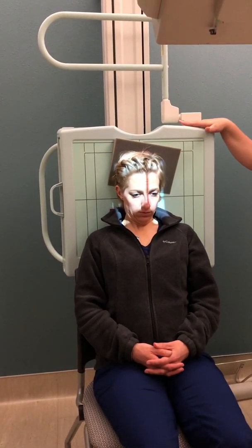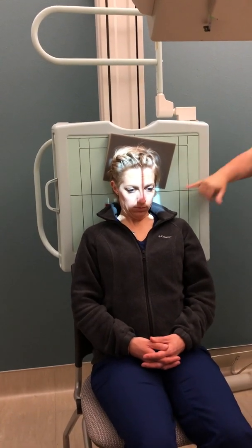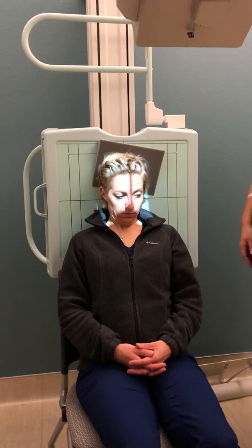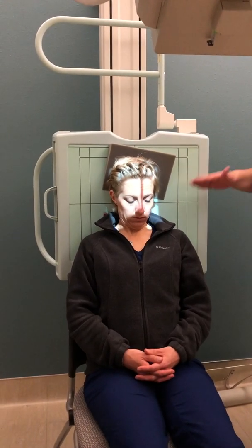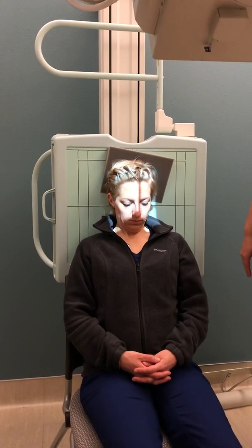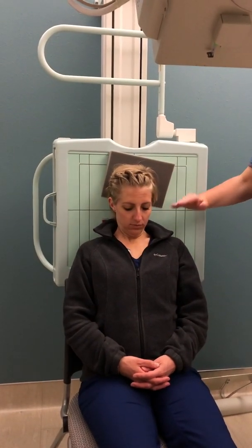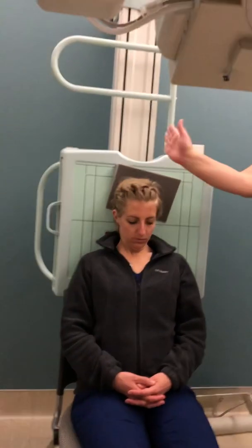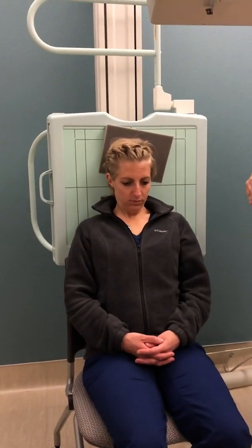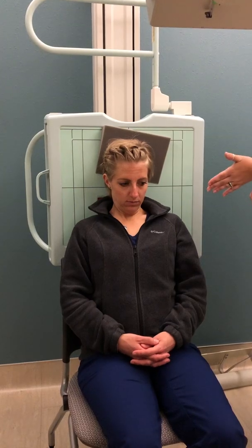Make sure that your bucky is in alignment so that you have that alignment for your resultant image. Again, OML perpendicular. We want mid sagittal plane perpendicular. And 30 degrees angle caudally.